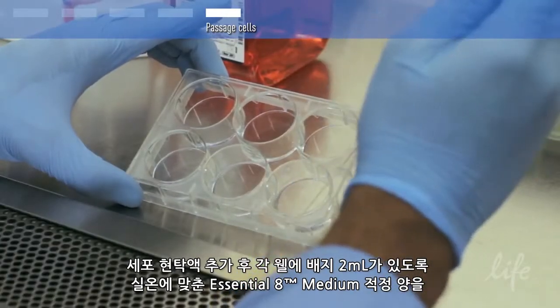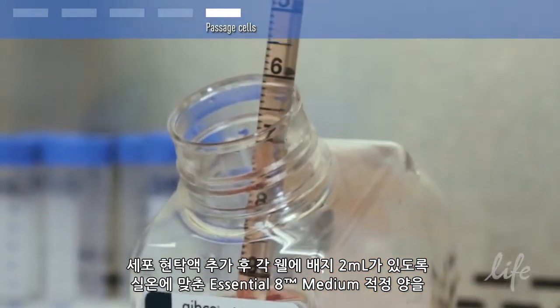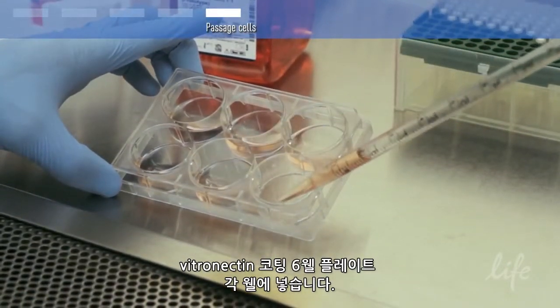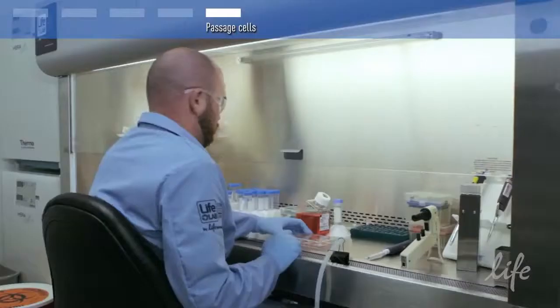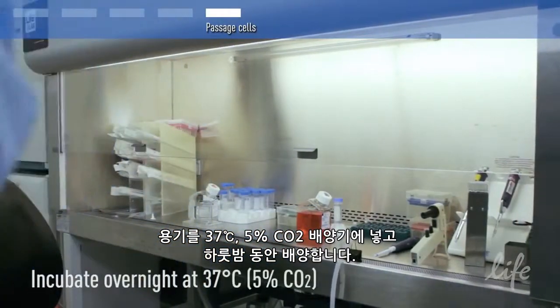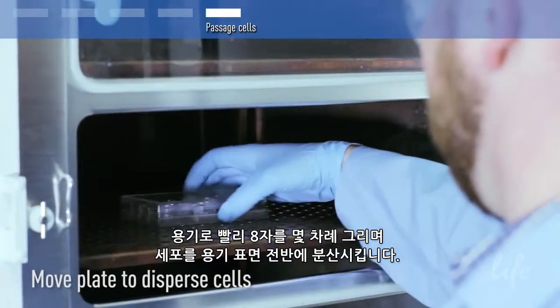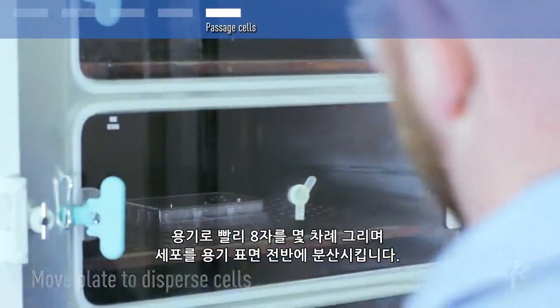Remove the vitronectin from a new vitronectin-coated 6-well plate and add an appropriate volume of pre-warmed Essential 8 medium to each well so that each well contains 2 ml of medium after the cell suspension has been added. Place the vessel gently into the 37 degrees Celsius, 5% CO2 incubator and incubate the cells overnight. Move the vessel in several quick figure-of-8 motions to disperse the cells across the surface of the vessel.